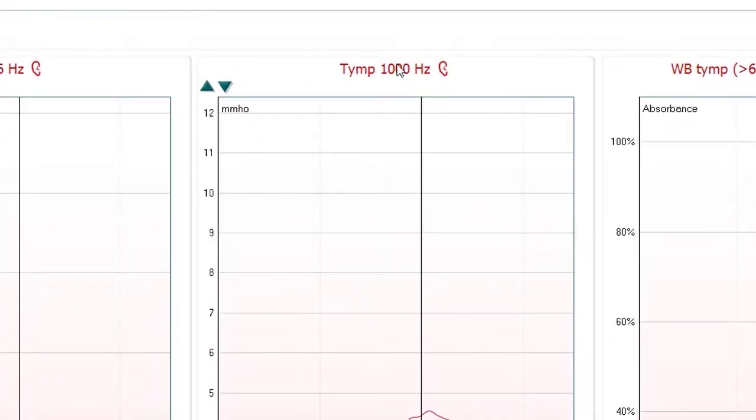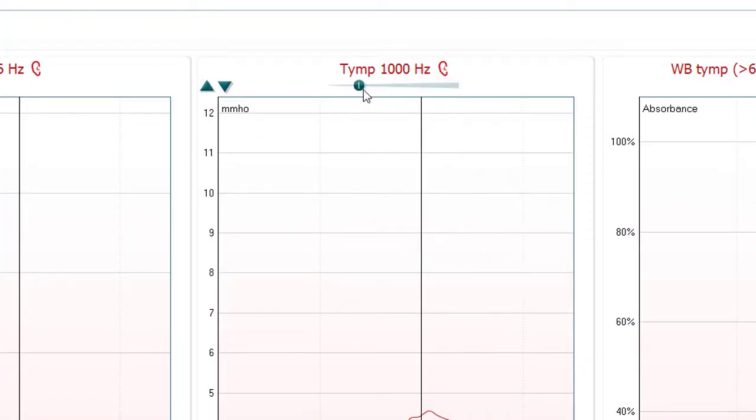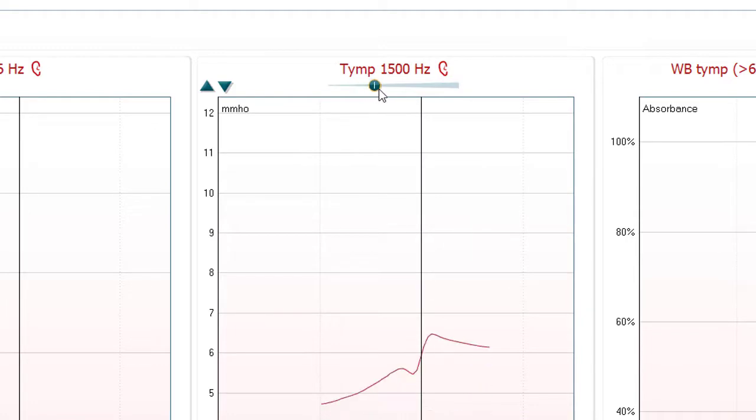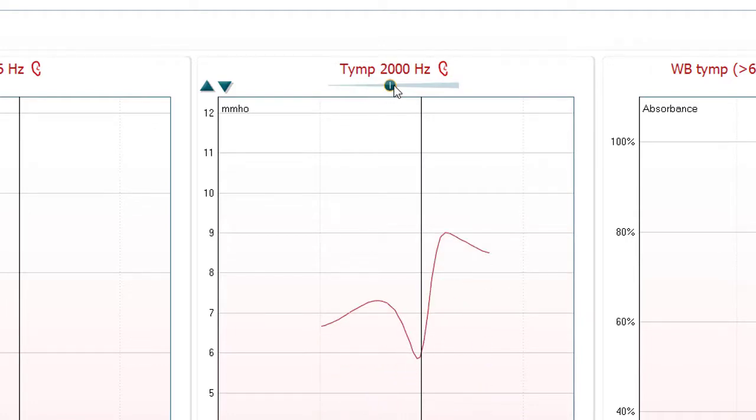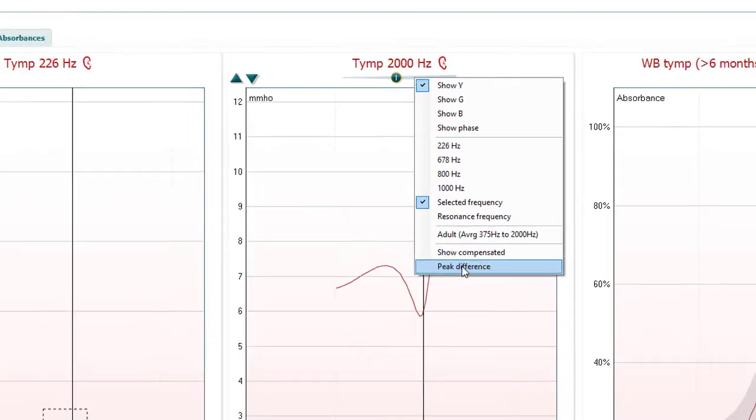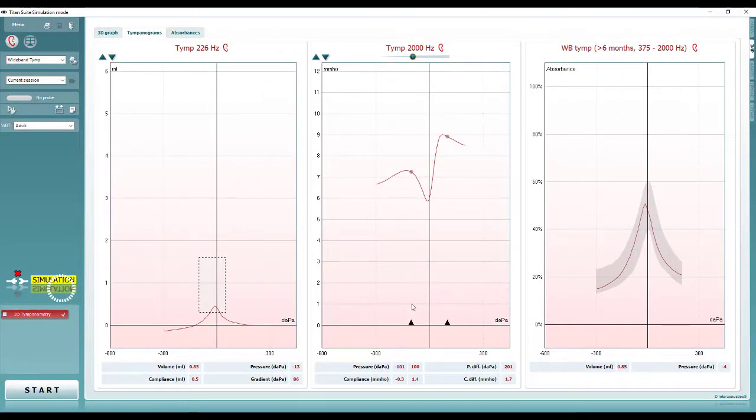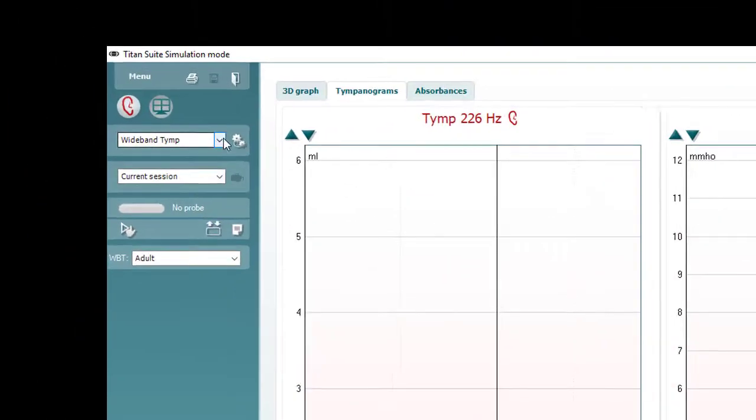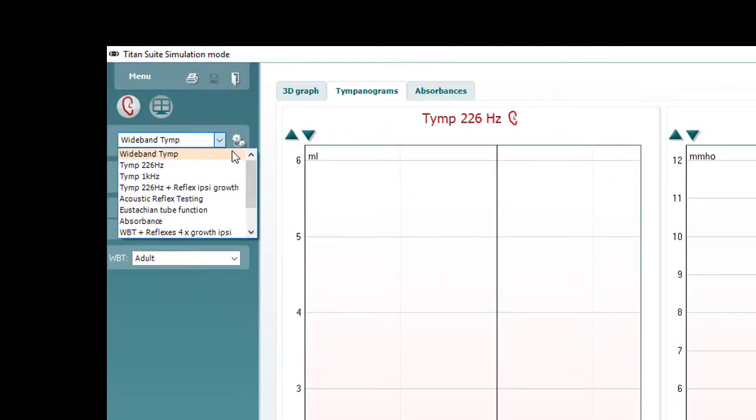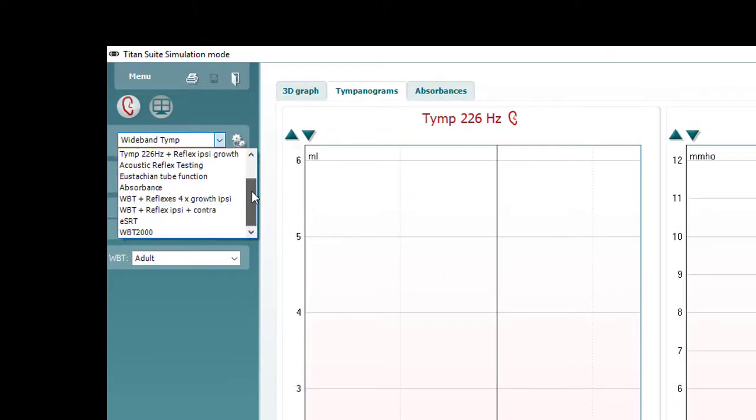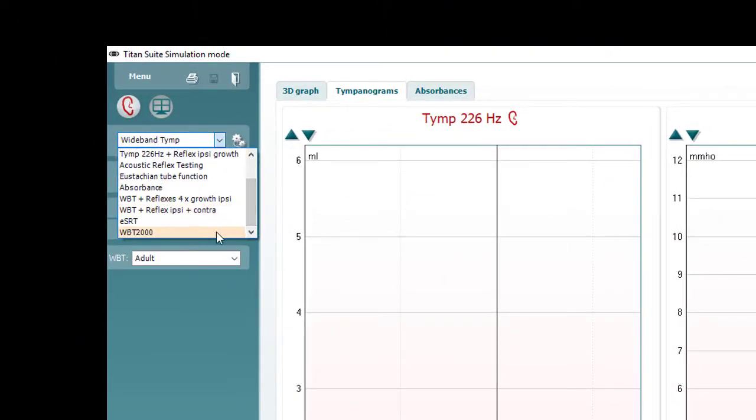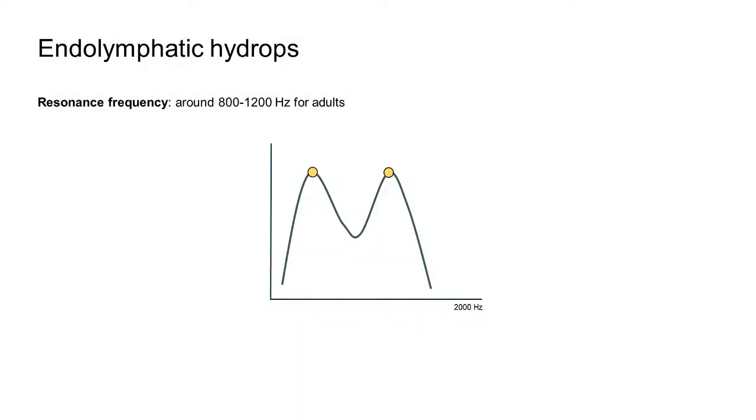In these cases, select the 2000 Hz tympanogram and inspect this graph in either the admittance or conductance view. Select the peak difference and use the indicators to measure the difference between the two peaks presented in this view. A preset protocol with these parameters is provided in the Titan suite. Studies have indicated that in ears with endolymphatic hydrops, this difference will be greater than in normal ears.